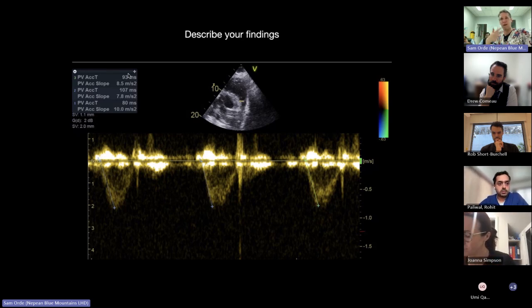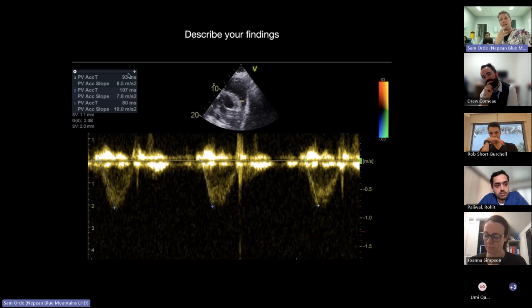Again, not pass or fail, but probably just my own bias. The flying W sign is indicative of significant pulmonary hypertension. Not always severe pulmonary hypertension, but it's often significant, enough to give you those reflected waves that you beautifully discussed. So nicely done. Another question that I thought, as you were talking, I could have asked is, what other views can you get this profile on?